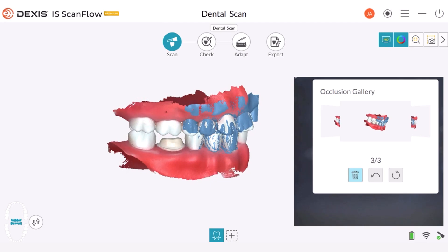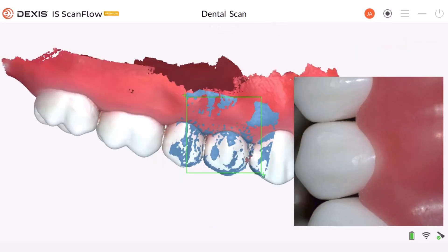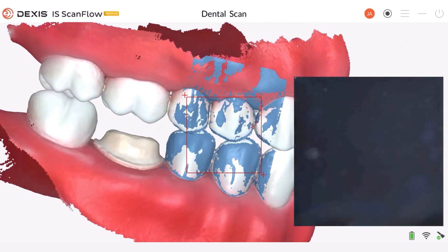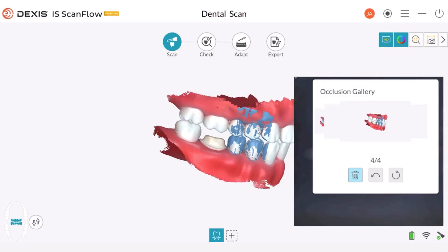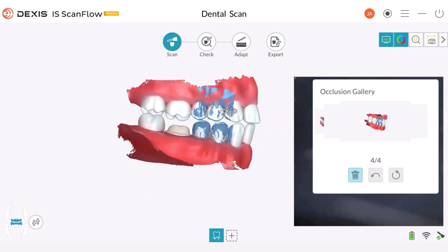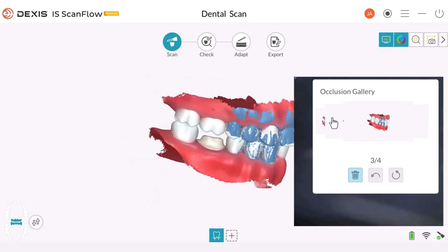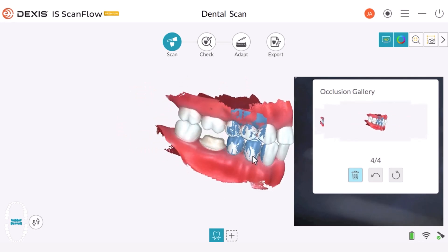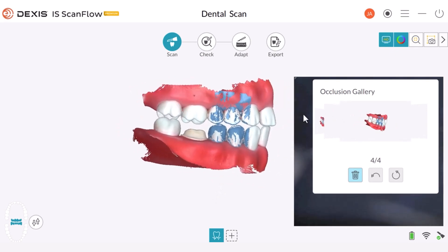In this case, the patient accidentally opened their mouth during the bite capture. That's why it's important to select and review each one of these bites and make sure that the bite looks accurate. In this example, the fourth bite is not correct, and we need to delete it because an incorrect bite can affect the accuracy of the bite. Deleting an individual bite is simple — select it and click the delete button.